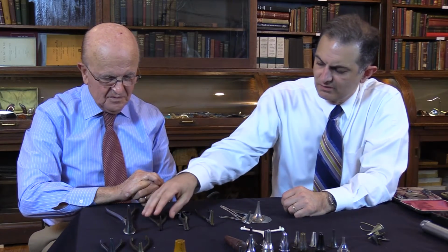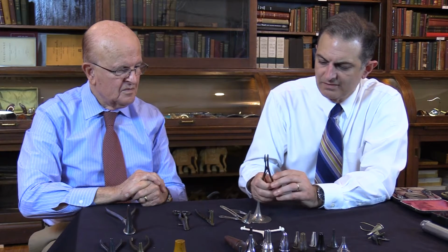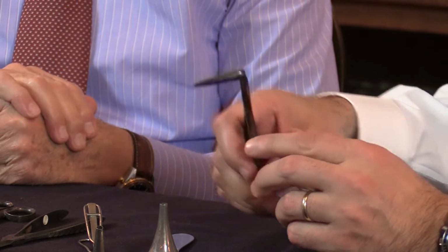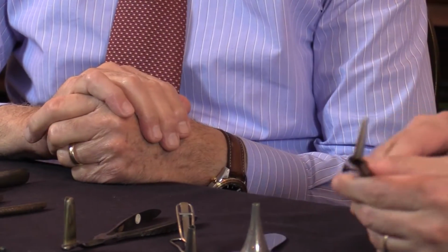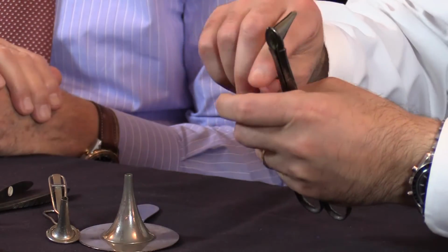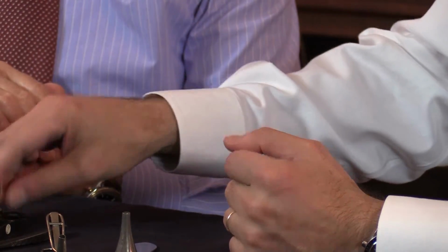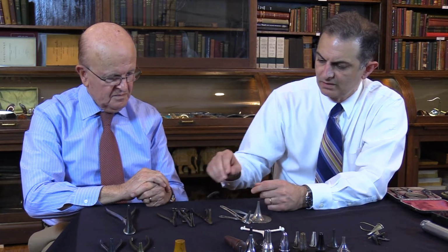So along the same lines as discussing the bivalve, we have the Perret pediatric or children's bivalve scope, which is very similar to what we use now as a nasal speculum, but just much more slender and a little bit easier to get into an ear canal of a cooperative child. Then the Robbie speculum. Now, instead of having ends that we would squeeze together, you dial it up with this screw and expand it as wide as you need to using that screw on the side. And another variation of a bivalve right here as well. And these were mid-18th century devices.